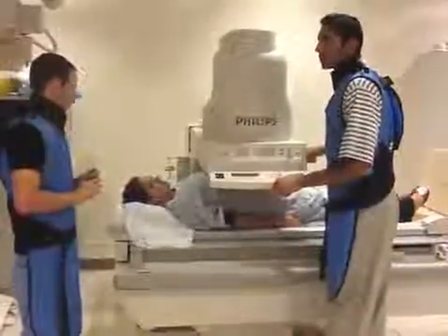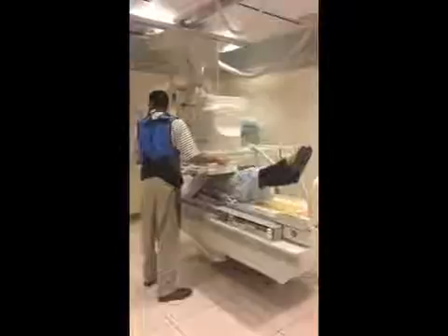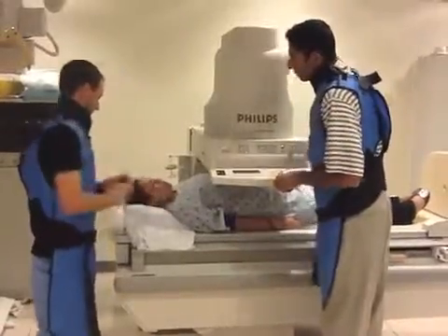Prior to performing the maneuvers, fluoroscopy over the GE junction to ensure that there is not a large amount of residual contrast in the esophagus. If there is, have the patient take several dry swallows. This is an example of gastroesophageal reflux.